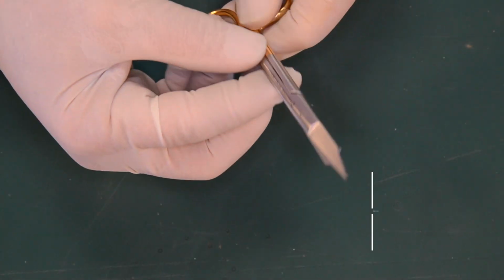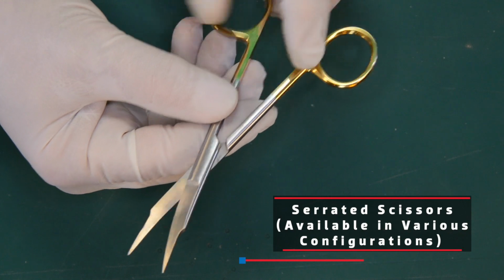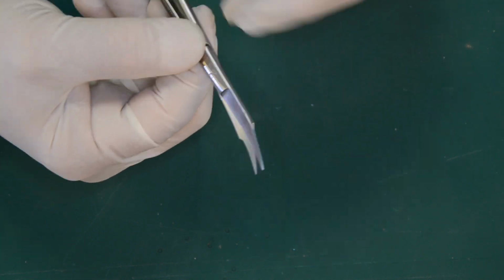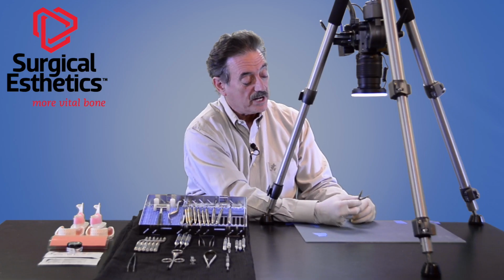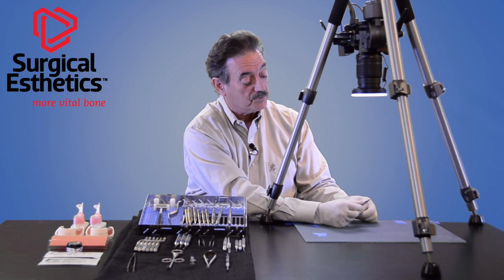Scissors. It's really important to have sharp scissors so that you're not frustrated, as I often have been in the past, trying to cut the suture while it moves out of the way. One of the things you want in your scissors is one side with a serrated edge. The serrated edge helps hold the suture in place, so when you go to cut it, it cuts effectively without moving away from your instrument.